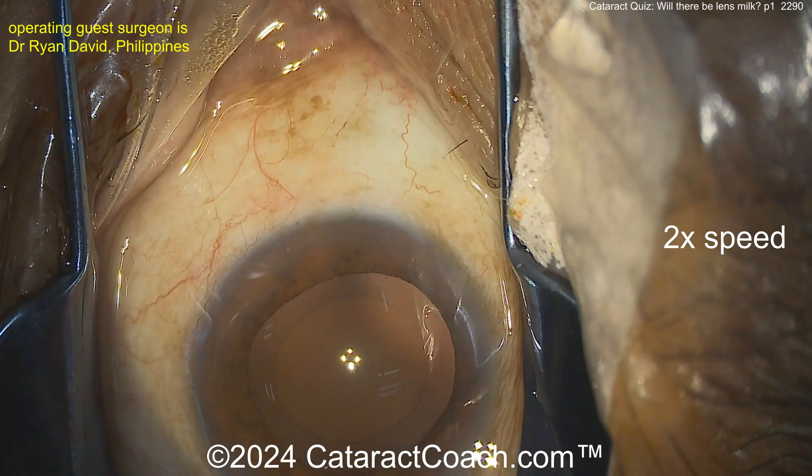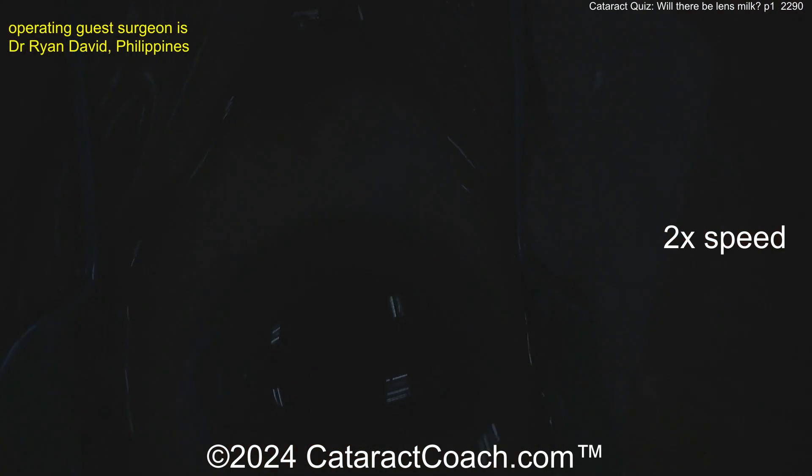This patient started off with essentially hand-motion vision - or as I like to say, wind-perception vision. Now it looks like the surgeon has turned the light off to load up the lens. I'm watching the video for the first time with you. I like that you're not putting excess light down the macula with the lights turned off - okay, get the lens loaded up. Looks like a young surgeon loading the lens yourself, which is fantastic.